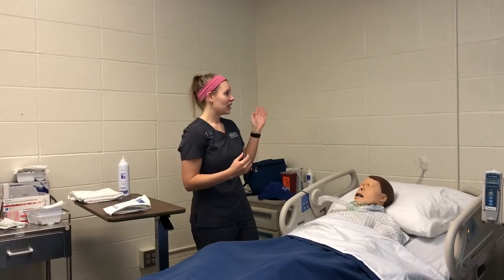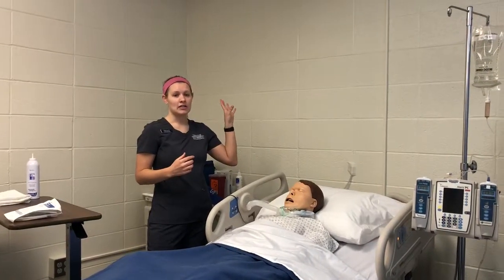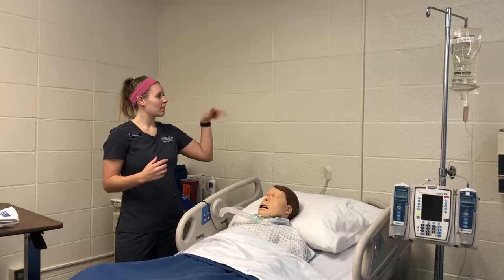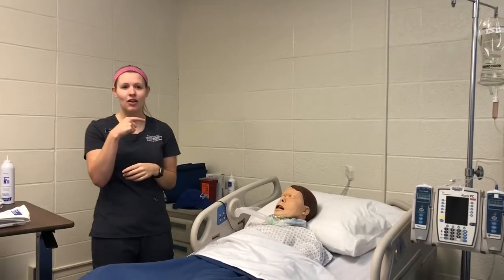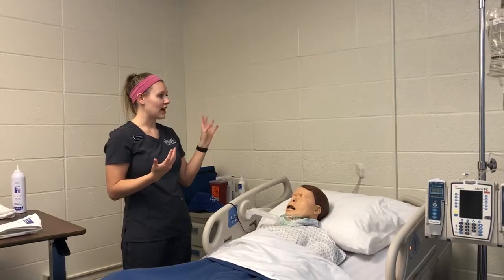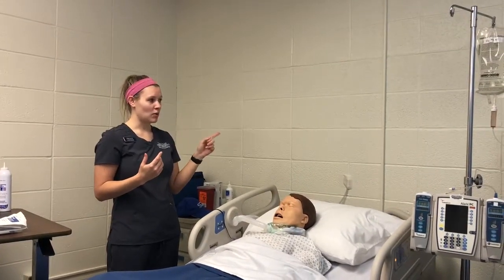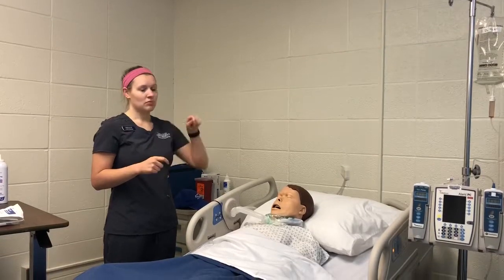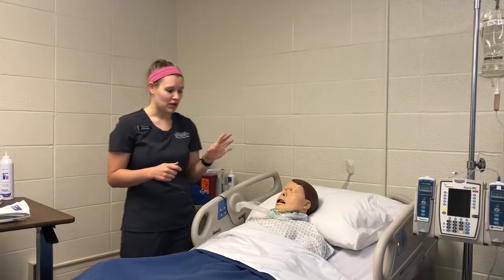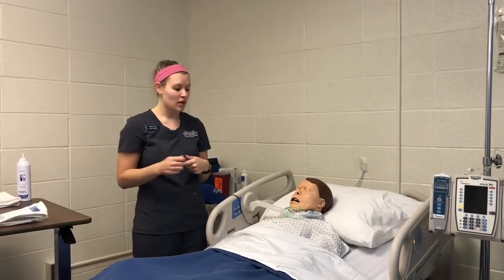So before we get started, we don't have actual suction and oxygen on the wall. So what I would do is make sure that my suction is set at 80 to 120, and that my oxygen would be turned all the way up, because I want to make sure that I'm hyperoxygenating my patient before I take away their oxygen and I'm doing their trach care.